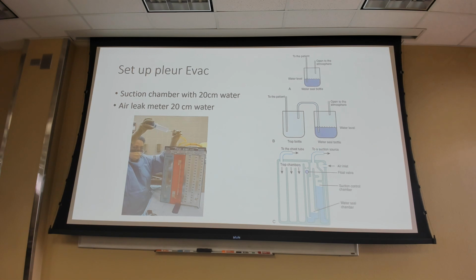So we tend to use a bunch of different brands. So you need to look at which one you have first. So it's good training to look at all your equipment. And if all else fails, they actually have instructions usually on the back. So it's important to read those and figure out where you're supposed to place that water prior to any operation. So it's nice that when you're in process at the ER, we would teach you guys how to do this, but some places may not and it might be busy. So it's important you guys look at how this operates.